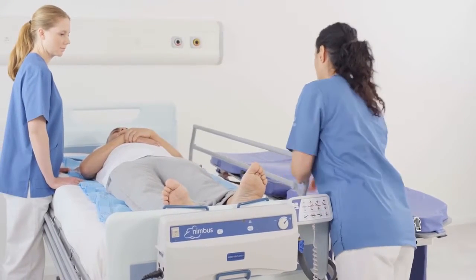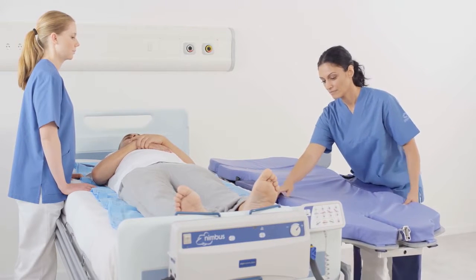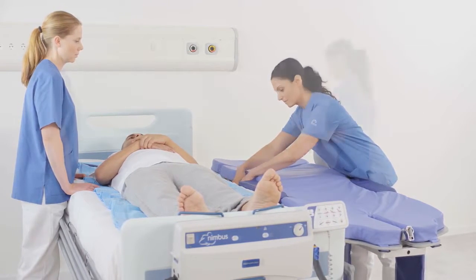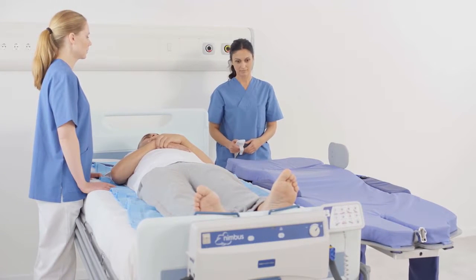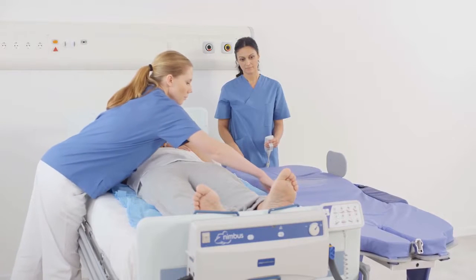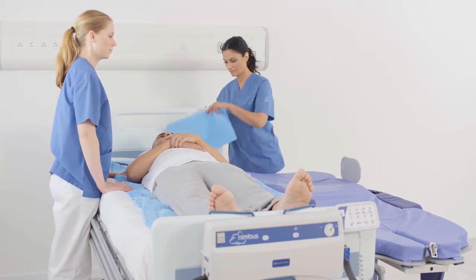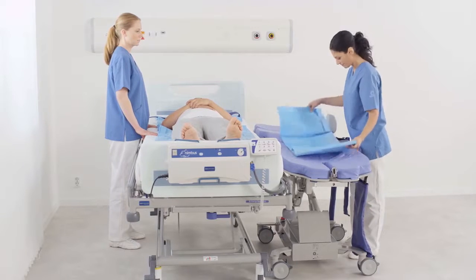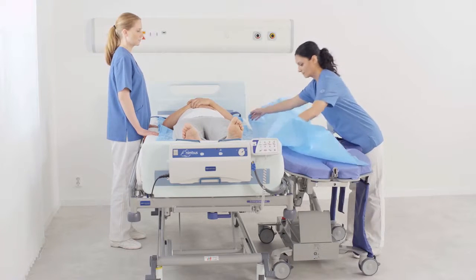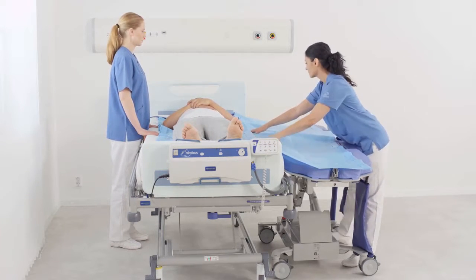Fold down the bed rail on the transfer side of the bed. Adjust the position of Sara Combilizer. Make sure the strap buckles are folded away. Using the hand control, adjust the height. Position the mattress slightly lower than the top of the bed mattress. Place a sliding aid on Sara Combilizer. Make sure the edge of sliding aid on the patient's bed overlaps the edge of the other sliding aid.